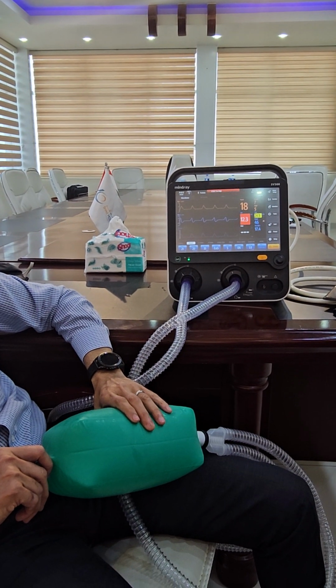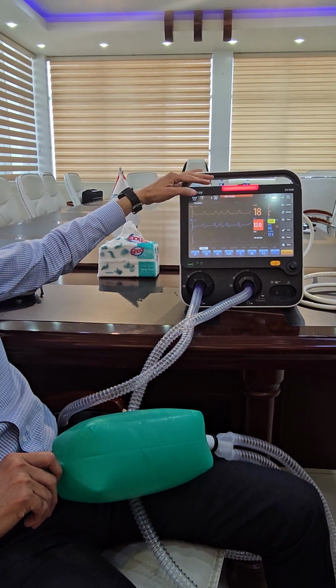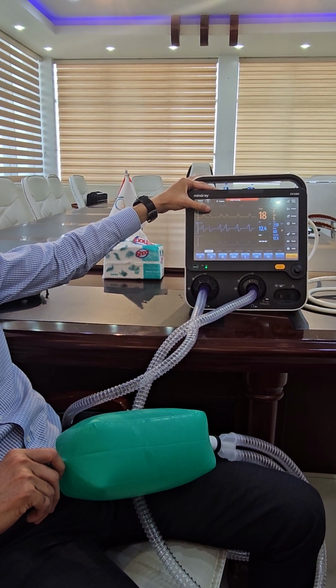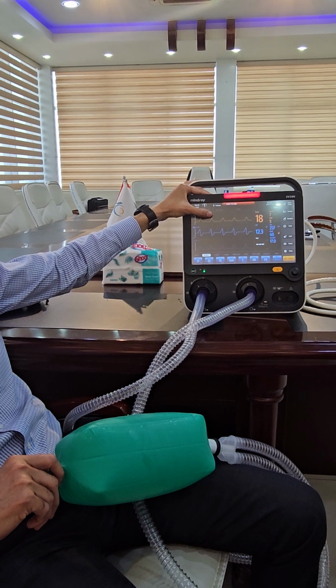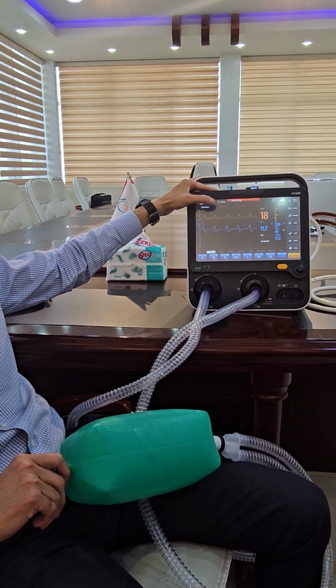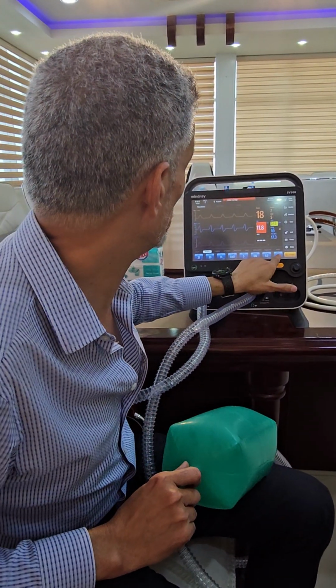Okay, so on this ventilator I've decreased the pressure. Look at this, very nice. This is pressure. Usually when you give more pressure, it becomes plateau. The pressure will become plateau if you give more. Now it's low, and then we need to increase the flow.